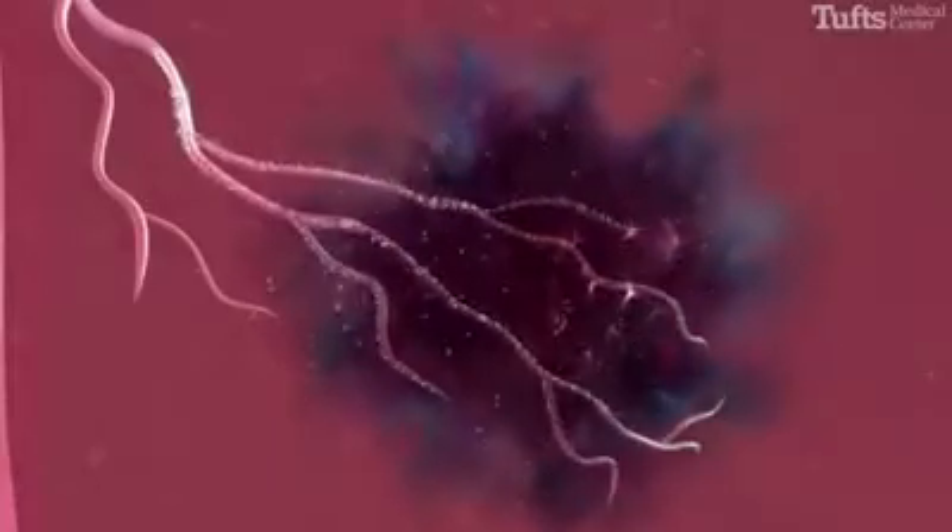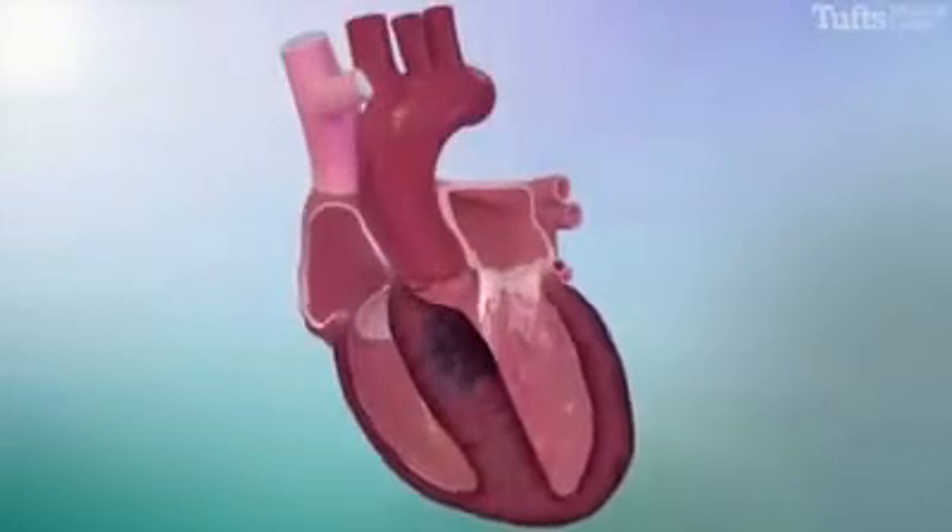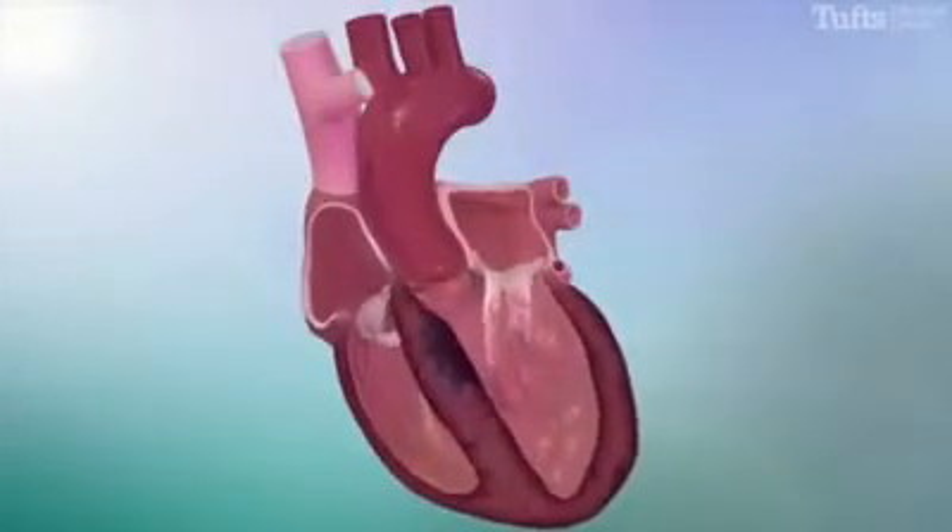The alcohol directly damages the heart muscle, which, over the course of several weeks to months, will reduce the thickness of the septum.